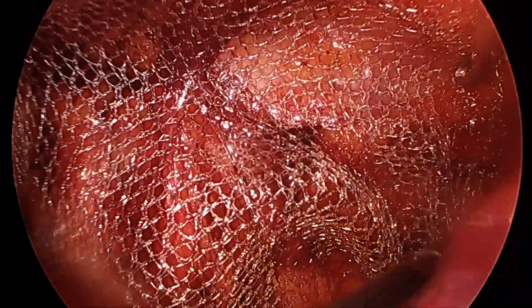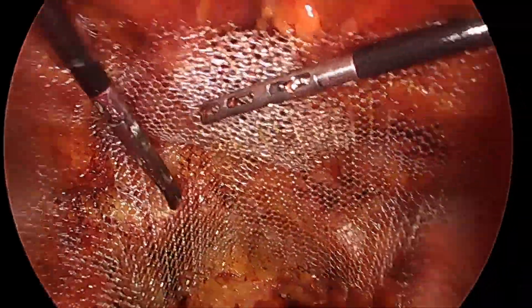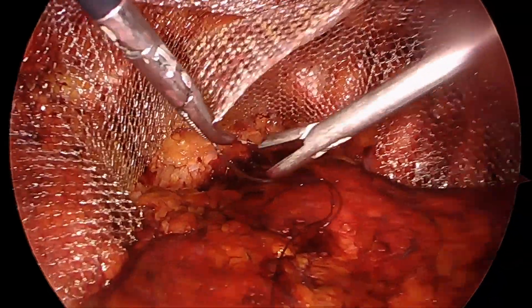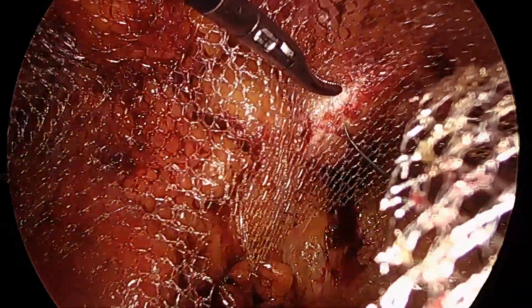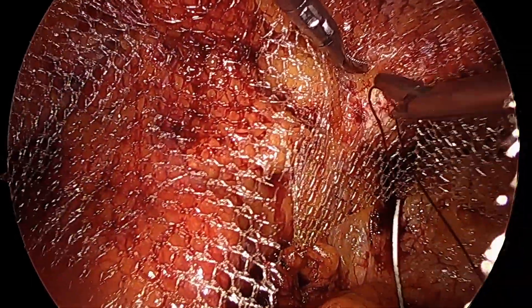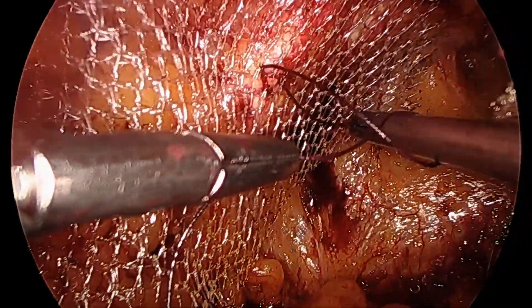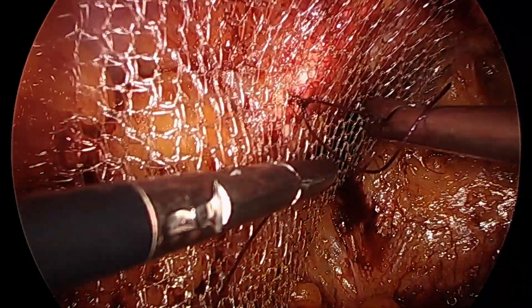This is a heavyweight polypropylene mesh, self-cut. We put both meshes on both sides, and because we're going to go back and work on the pelvis, I prefer to make a little fixation so the mesh isn't shifted out of its rightful position while we work on the ventral part of the abdomen.